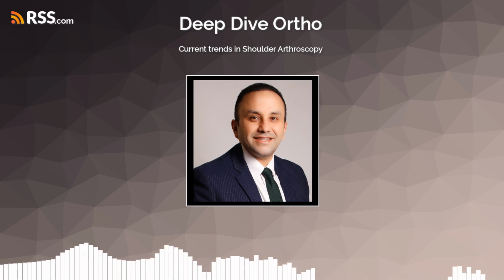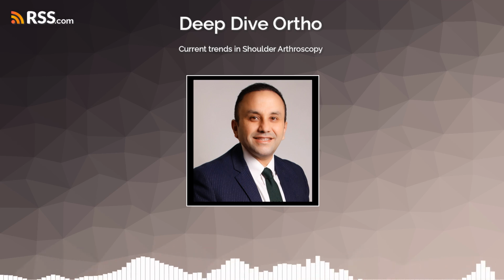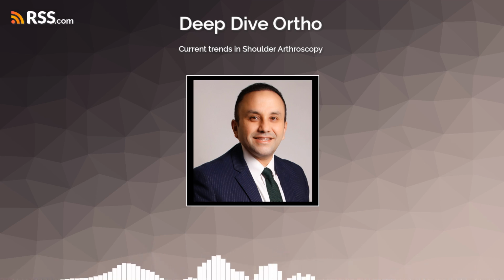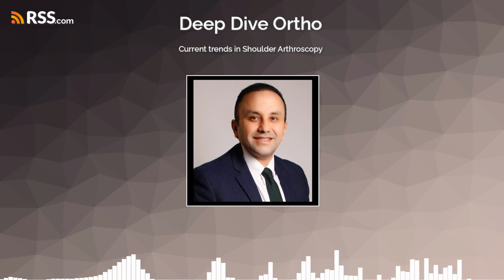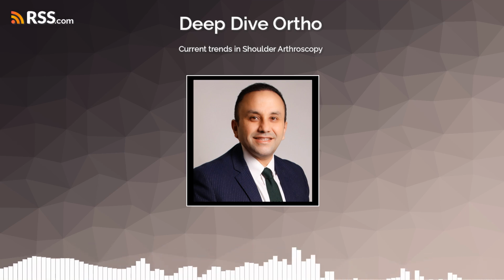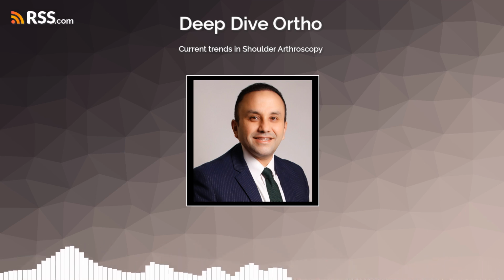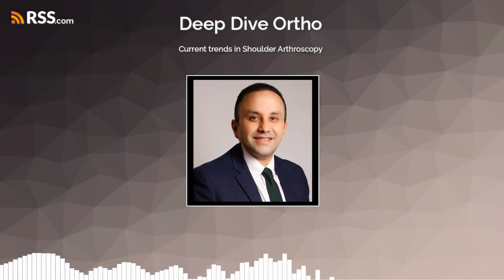And techniques for fixing those fragments arthroscopically. Surgeons often use specific techniques, like the double pulley technique, to get a really secure hold on those bony fragments during the arthroscopic repair. What about the success rates of these arthroscopic Bankart repairs? Does it matter if the shoulder has been dislocating for a while versus, say, a first-time dislocation?